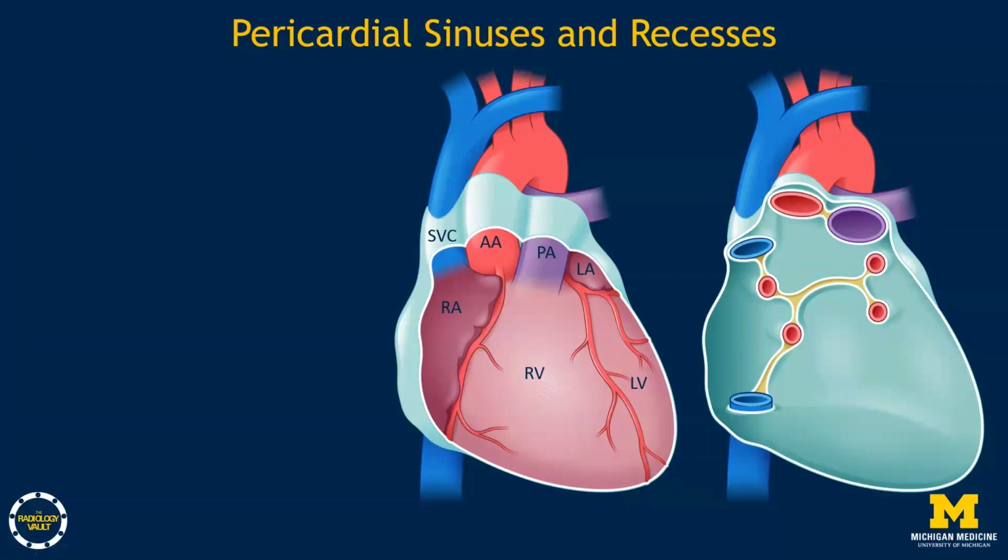Now let's imagine that we removed the heart and this is the posterior part of the pericardium from inside. We will see portions of the big vessels and the attachment of the four pulmonary veins, which we can see here. You will notice that at the base of the heart, the pericardium forms many reflections around the great vessels, forming what we call recesses and sinuses.